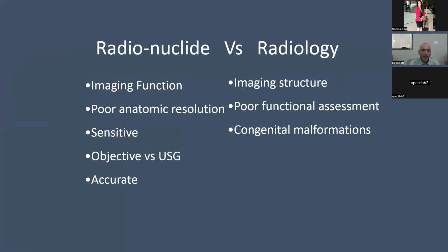So between conventional radiology and nuclear medicine, the principal difference is, as you all know, that radionuclides provide exquisite functional information with significant compromise in structural resolution, whereas conventional radiology, be it CT, ultrasound, MR, provides excellent structural information. Any indirect functional information coming is purely complementary and coincidental.